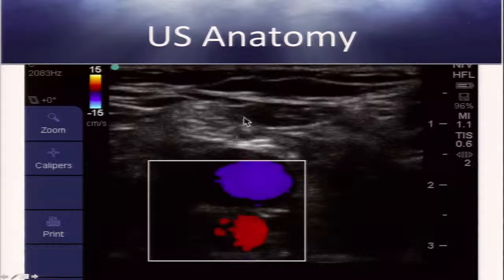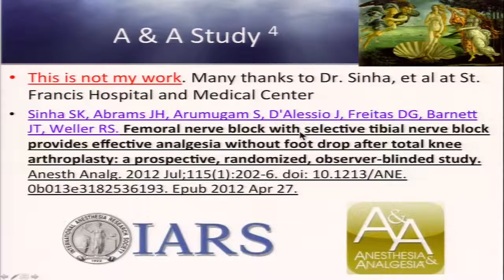This is your tibial nerve in the popliteal fossa. This is your popliteal vein and artery. And this is the common peroneal nerve. And in here, you may see the lateral geniculate artery in some patients. In some patients, it does not show up very well.